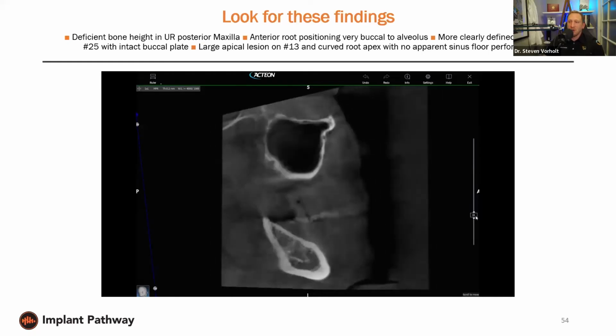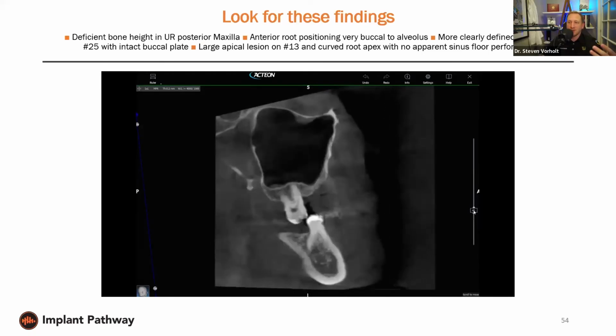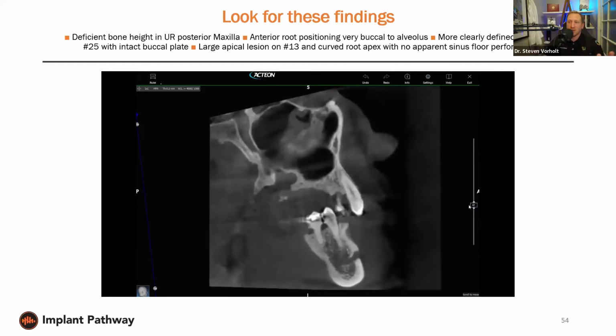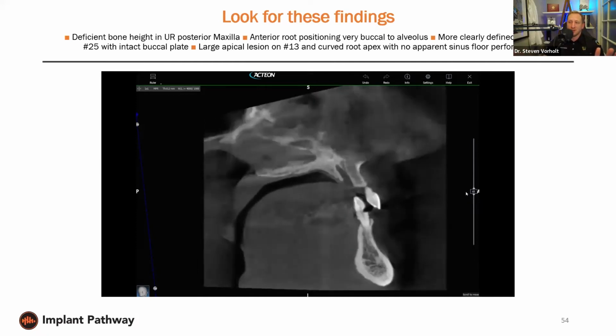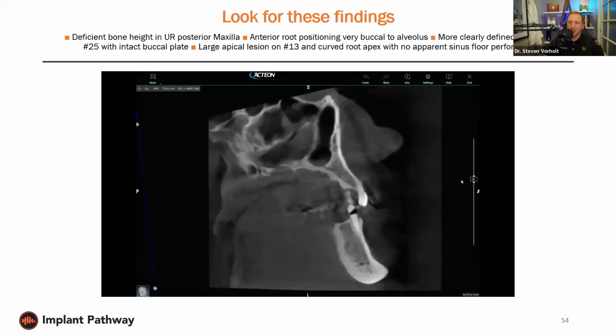So we're scrolling all the way to one side. We get a good view of the IA as it dives through the mandible. We start to see the teeth in the posterior from the lateral view, like you would in the bite wing. And then here in the anterior, we see the buccolingual dimension. There's the nasopalatine canal, and at the midline, we can stop and see the airway, epiglottis, and so on.